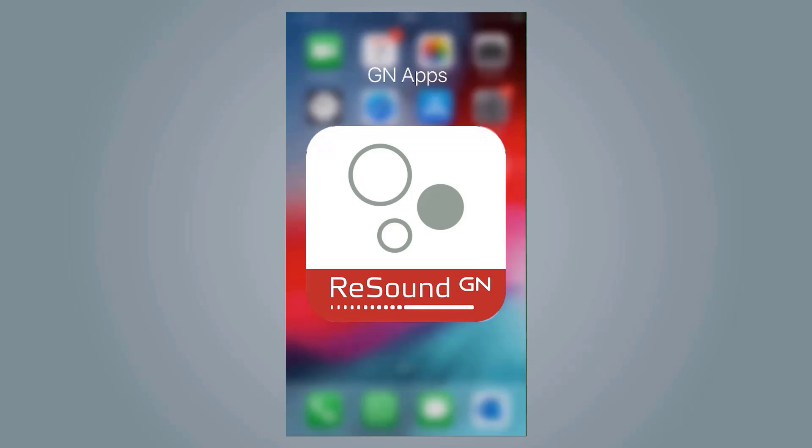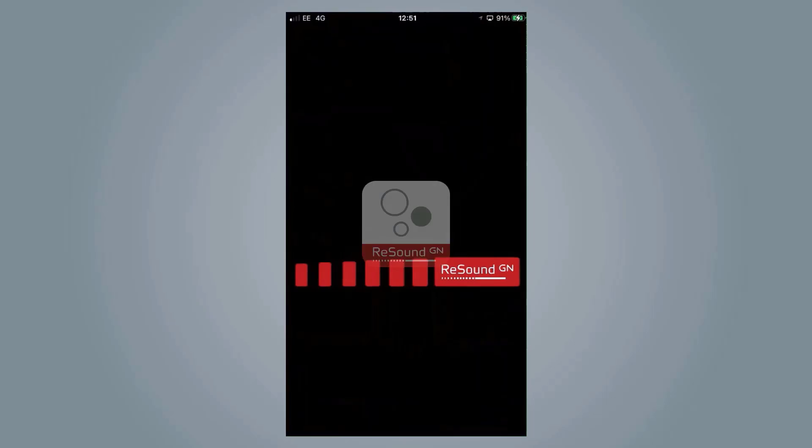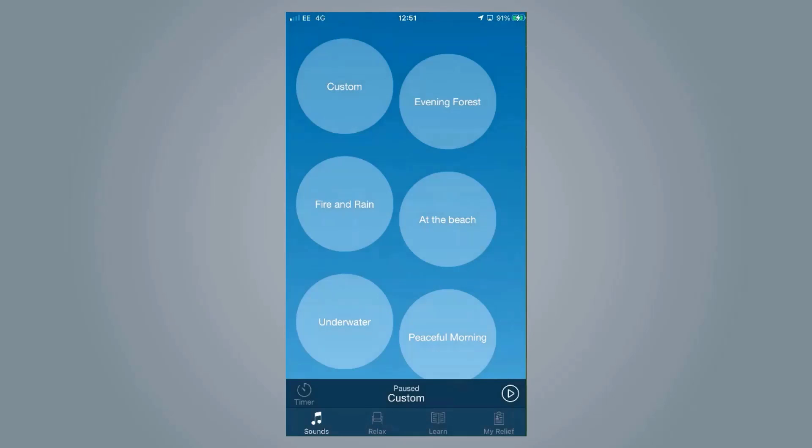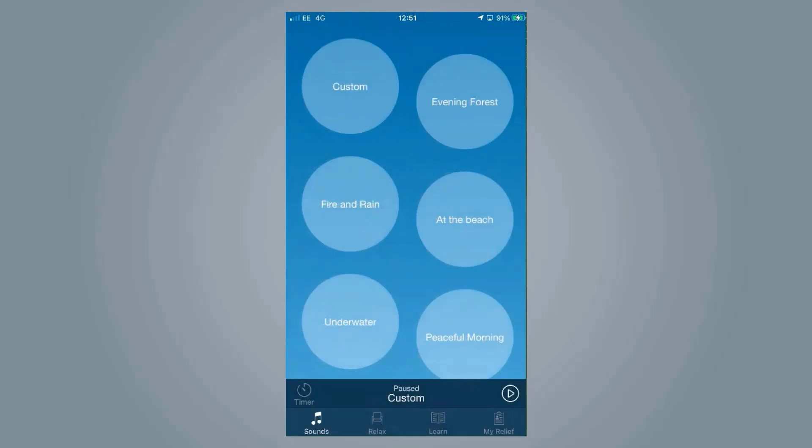Our second option for support for tinnitus is our Relief app. Now what's really important to know, and actually really, really good, is that this app isn't designed to be used purely with GN and ReSound hearing aids.